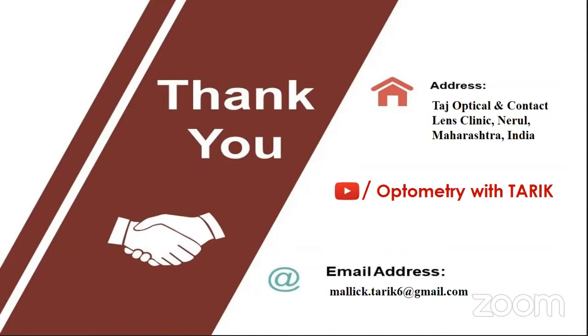Thank you, sir. Moving on to the next question, Miss Anjali Saha wants to know, how can we eliminate monocular cues while performing stereopsis? The simplest way is to use Randot. As I said, the charts are made in such a way, because the Randot stereo test gets its name from the randomization.